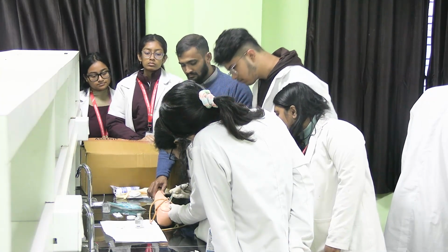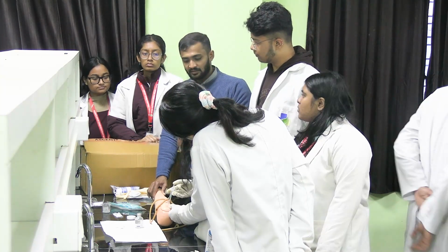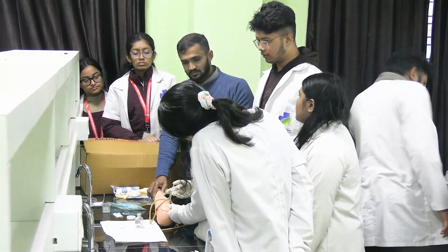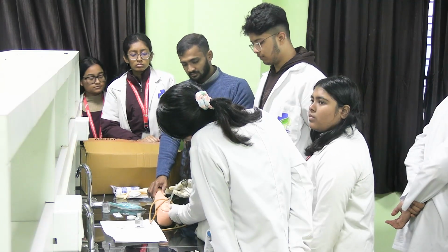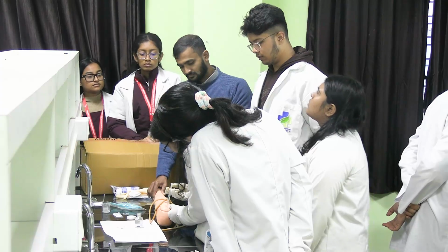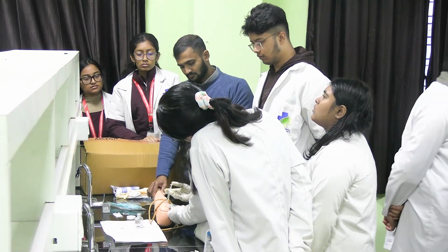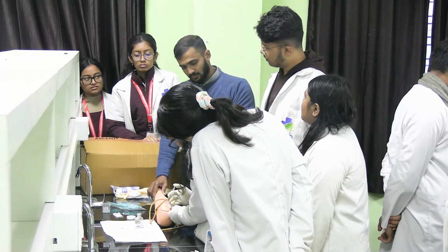Now what is the next step? You have to be fast and firm. Next is to check for a blood vessel, whether there is a blood vessel or not. No blood is coming. Then it is safe to introduce the drug. Introduce the drug.